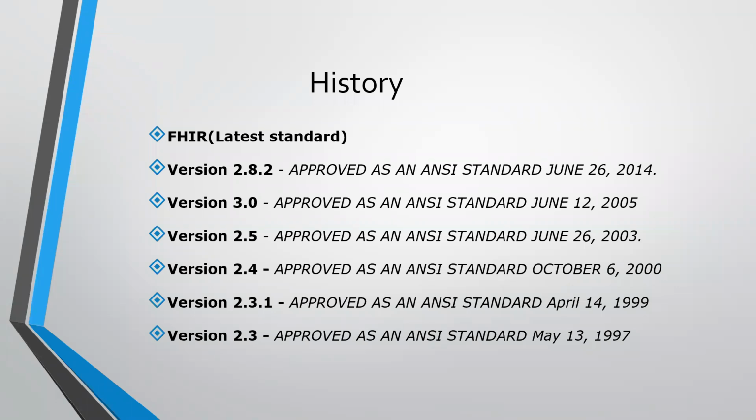Because it may have new features or bug fixes, something like that, right? Apparently, at the end of the day, you are upgrading it because you get a value, right? So that significant value was not pretty much added by version 3.0. By the time version 3.0 was released, 2.x was already established. Most of the hospitals are on 2.x. They are already satisfying their need of integrating with various applications. Why would they move to 3.0 if it is not adding any value?